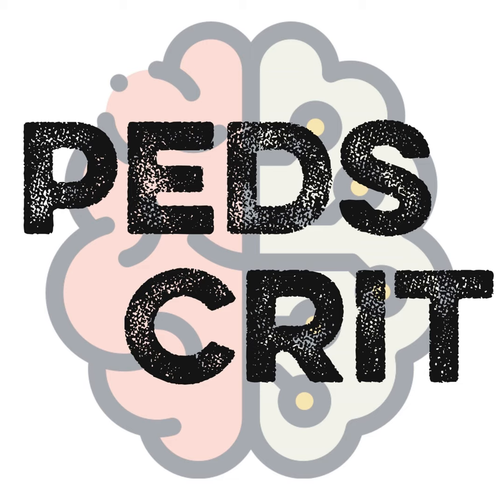And we didn't talk about this, but the whole reason that we have to anticoagulate patients on ECMO is because as your patient's blood is leaving the body and going through this ECMO circuit, it recognizes that this circuit is foreign. These are not my normal vessels, and it starts forming clots. But what if we had a new circuit that the body didn't recognize as foreign? Then that may completely eliminate, or at least significantly decrease, the amount of anticoagulation that we'll need to use. So I'm really interested to see what new technological advancements we come up with.